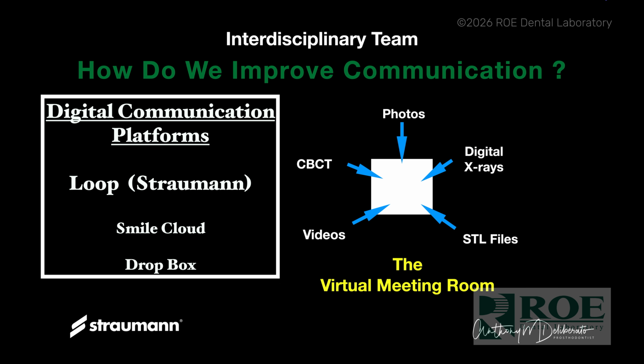It used to be that when we had a complex case and we were going to work as a multidisciplinary team, it would be very difficult to get everyone together to talk about our thoughts on the case, to share information. But today we have all these digital communication platforms that allow us to do this very easily. There's Loop from Straumann, there's SmileCloud from Straumann, and there's Dropbox. We can basically create a virtual meeting room where we can put our photos, our digital x-rays, our STL files, our CBCT, and our videos.